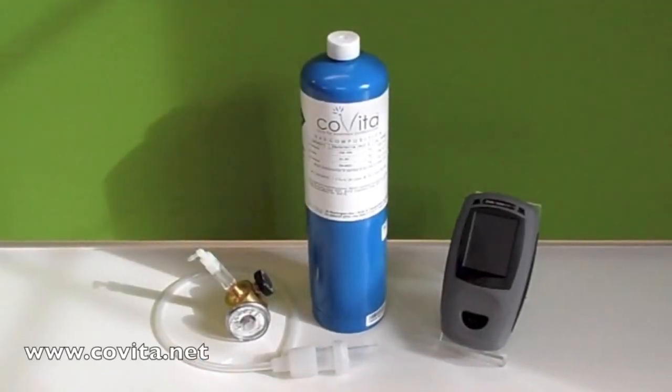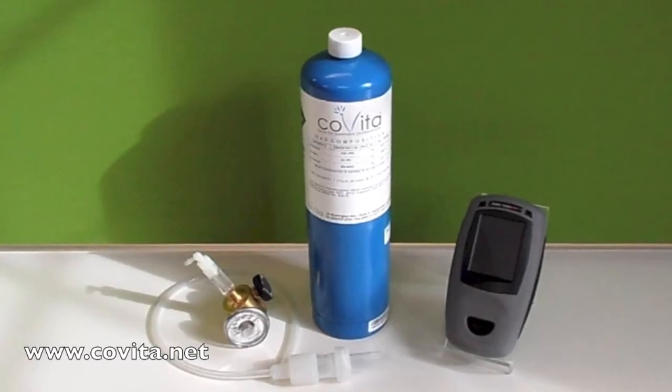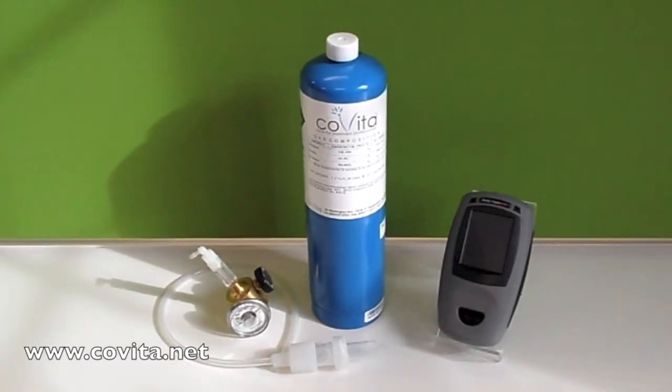Welcome to the Covita Gastrolyzer Plus Gastrolyzer Calibration video. To calibrate your monitor, you will need five components: your Gastro Plus Gastrolyzer monitor, your tank of 100 ppm hydrogen gas, the flow meter regulator, the calibration cali-adapter tubing, and the D-piece one-way valve.